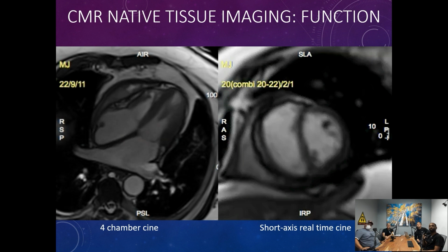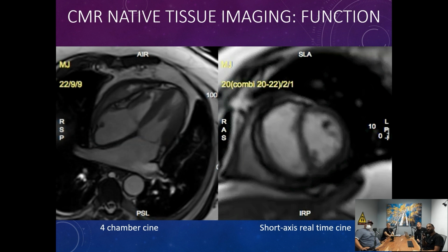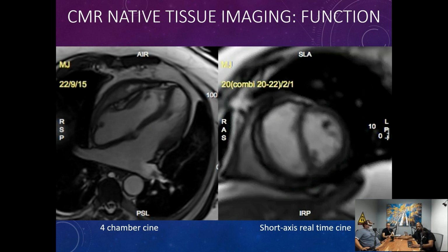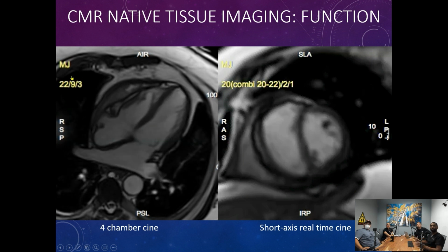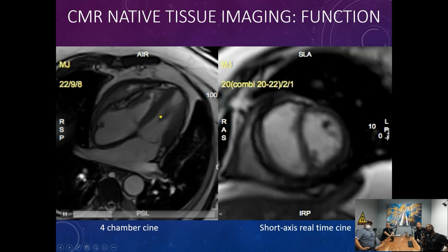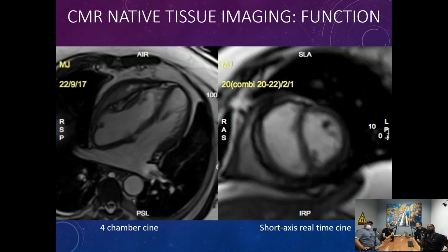Plus, we give it a little help with a rewinding gradient, which is a bit of the principle behind SSFP. And you can appreciate here, this is an example of a patient with pericarditis. You can see here, if I move my arrow, this is the heart. This is the wrapping around the heart, the pericardium. You can see that there's thickening here. And you see the heart muscle, the right ventricle, the left ventricle, left atrium, right atrium. You see the pulmonary veins that bring back the blood from the lungs to the left side. And then you see the septum, the wall between the two ventricles, which is wiggly a little bit. So this is an example of an abnormal septal motion that we see.